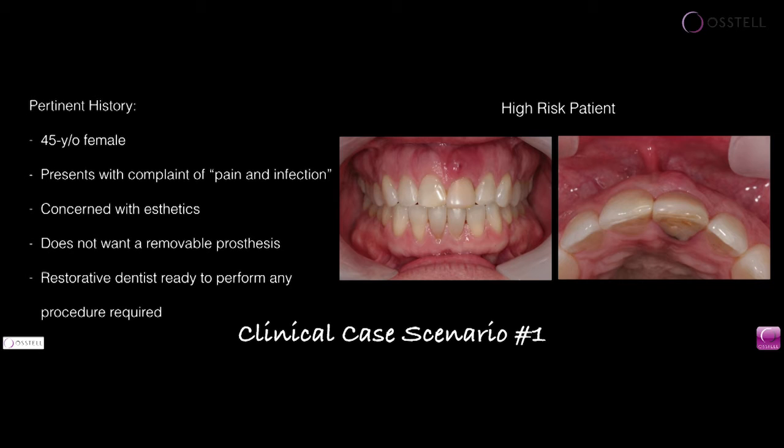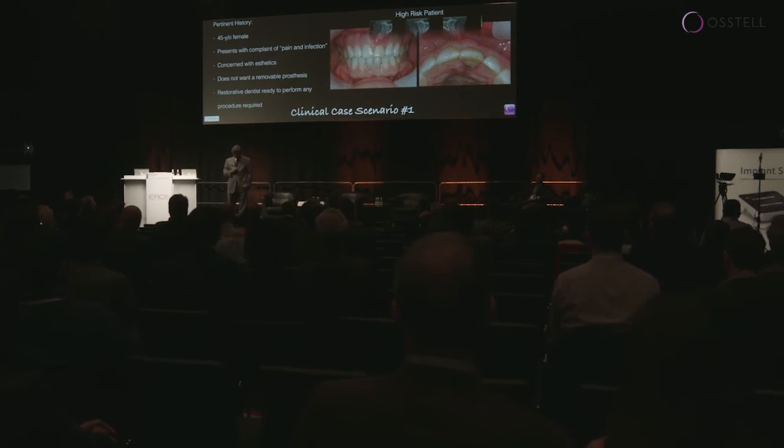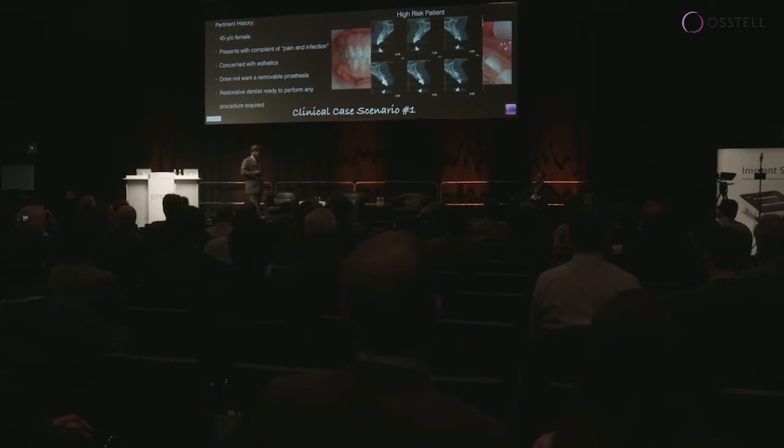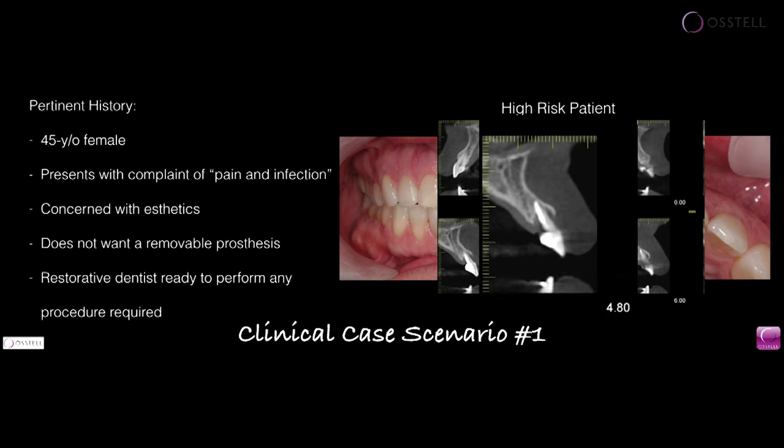I'm ready to do anything for this patient, whether it's going to be putting a crown on the implant, putting a provisional removable prosthesis, or what have you. So, we all want to see x-rays, okay? So this is the x-ray. And if you really want to see it in high definition, here is the tooth.